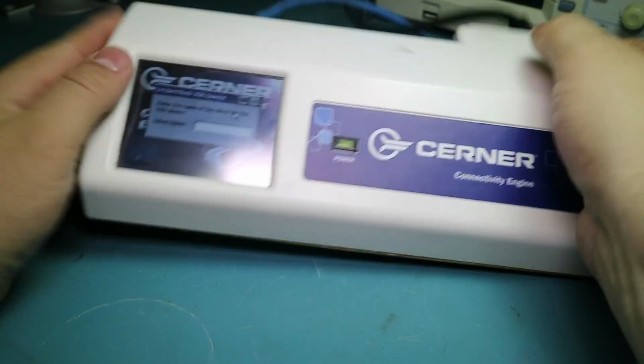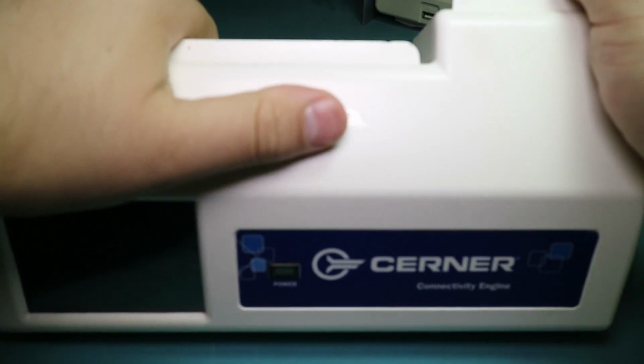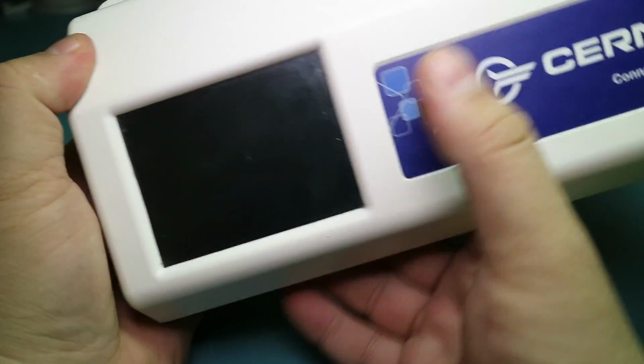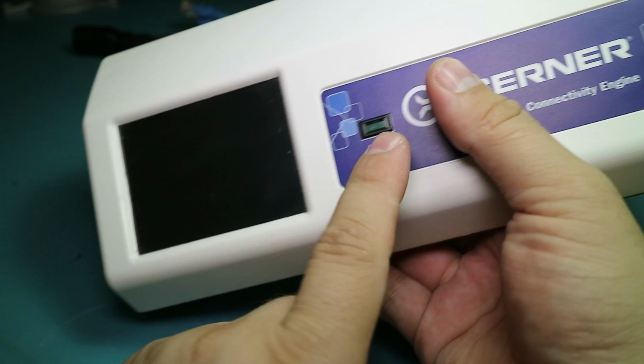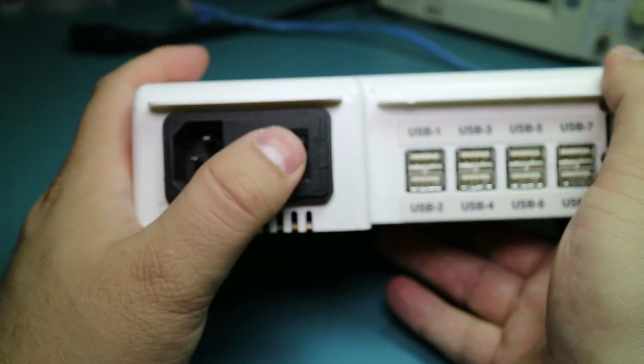So whatever it needs to do, it's obviously not doing it. So let's just take it apart. And as you can hear, it had quite a loud fan. So getting into this thing, we've got the TFT screen, which has a touch sensor. It's very crappy. It's probably resistive touch, so you have to really press down. Little power LED, and like I said, it says demo unit. And on the back we have an IEC power connector and a switch.